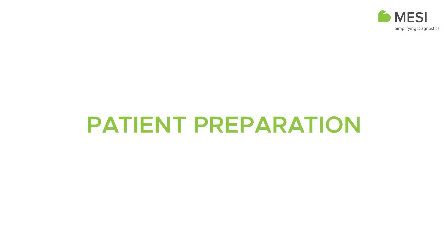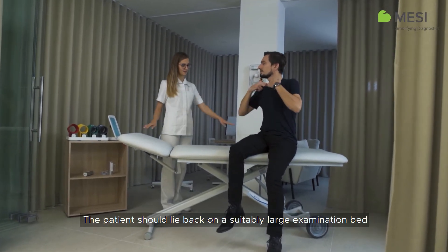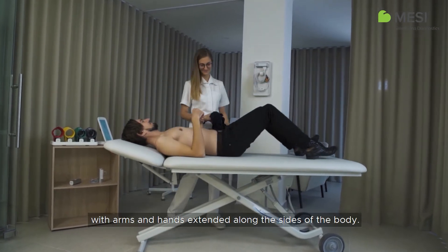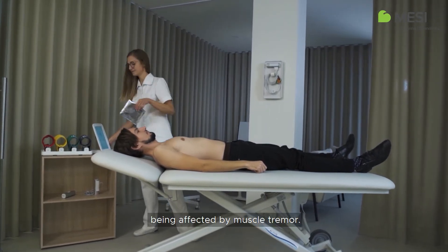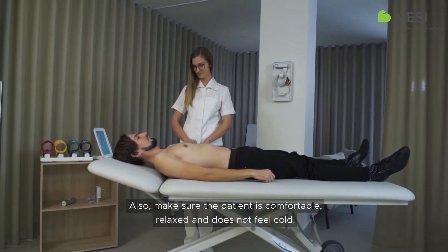Patient Preparation. The patient should lie back on a suitably large examination bed in a supine position with arms and hands extended along the sides of the body. This will minimize the likelihood of the ECG trace being affected by muscle tremor. Also make sure the patient is comfortable, relaxed and does not feel cold.